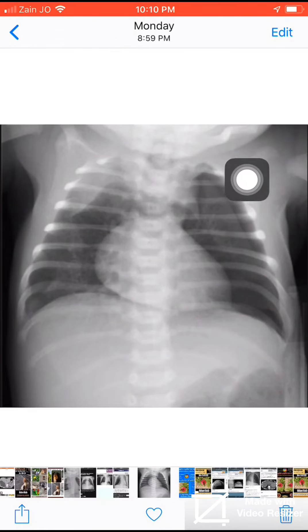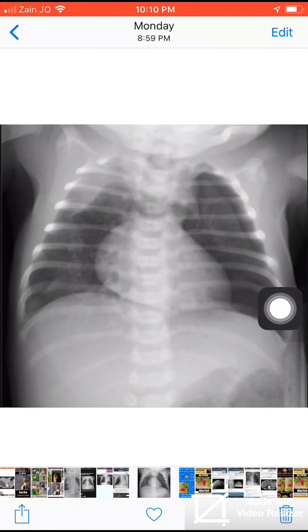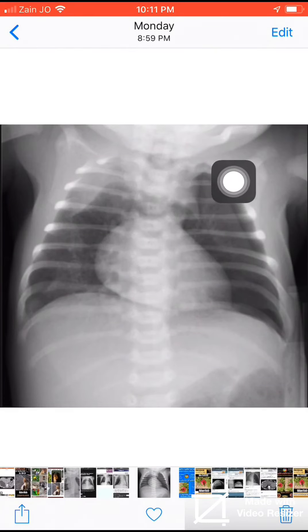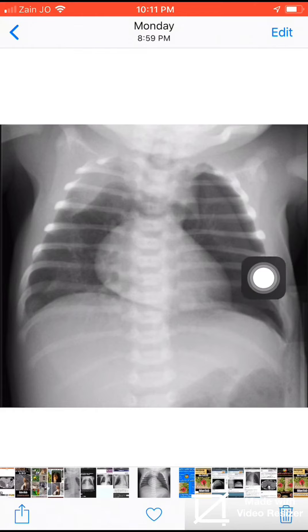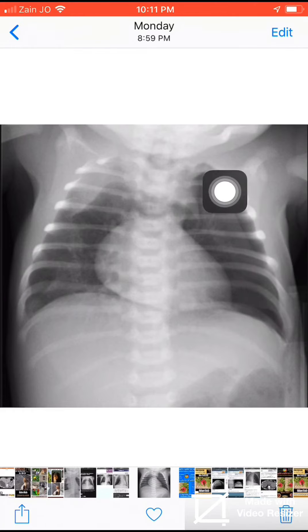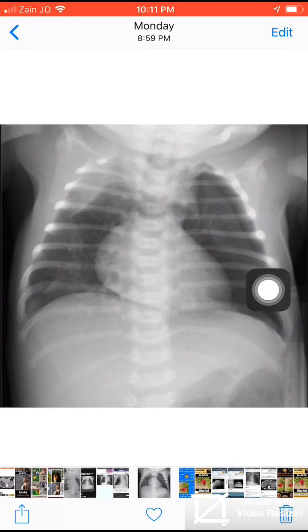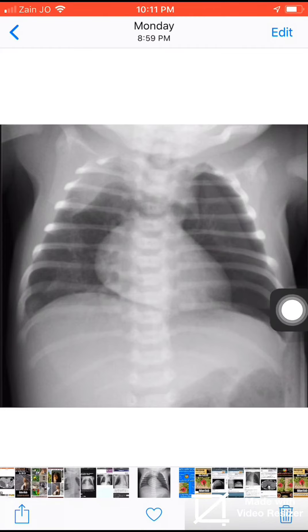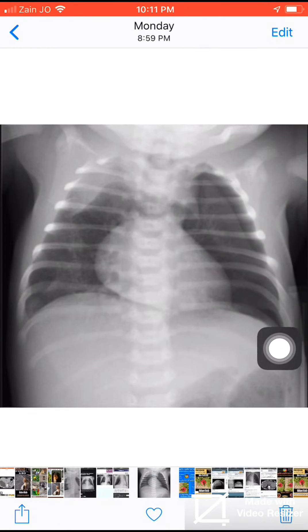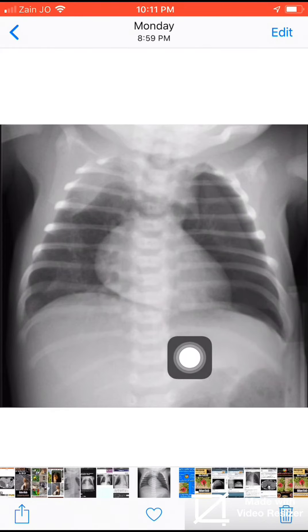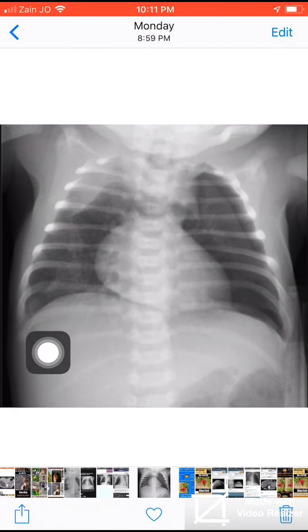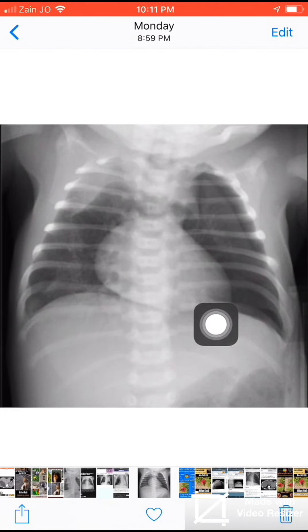There is left-sided pneumothorax causing some collapse of the lung on the left side with hyperlucency. The costophrenic angle on the left side is a little bit deeper than on the right side.